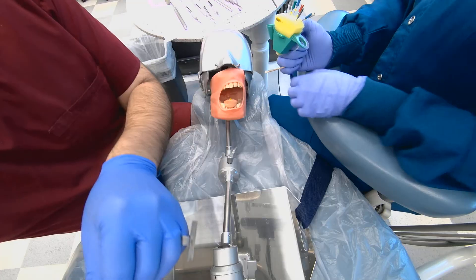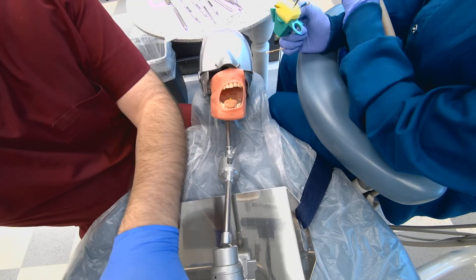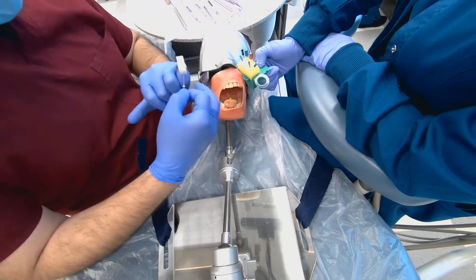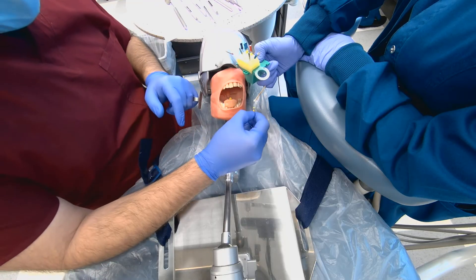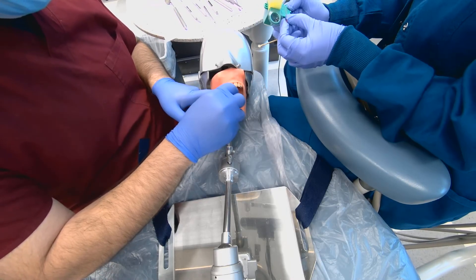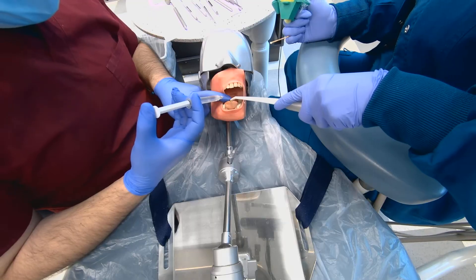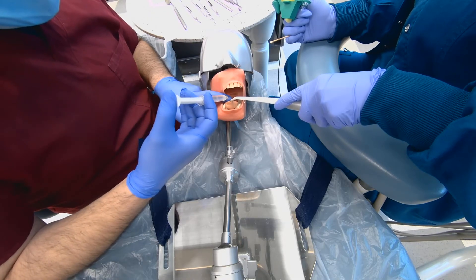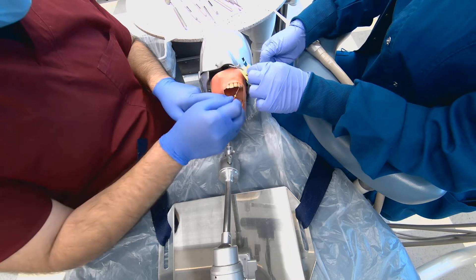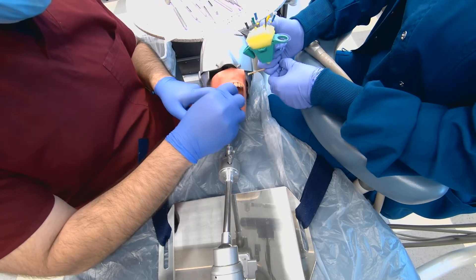We also have an irrigating syringe which has diluted bleach in it. Sometimes EDTA is also used, but this is to irrigate. We use one file at a time — measure it, use the RC prep, and then start cleaning the canal. Then we prepare the next one, irrigate, and continue. We've got to 25 now, so we can prepare 30.